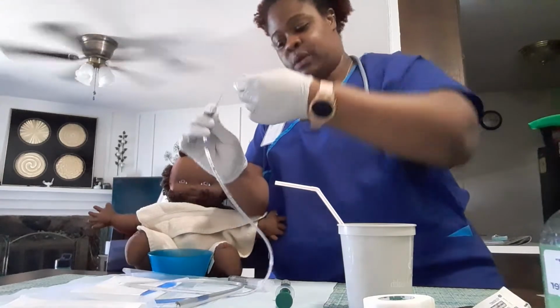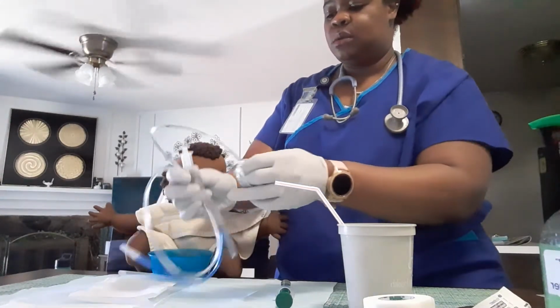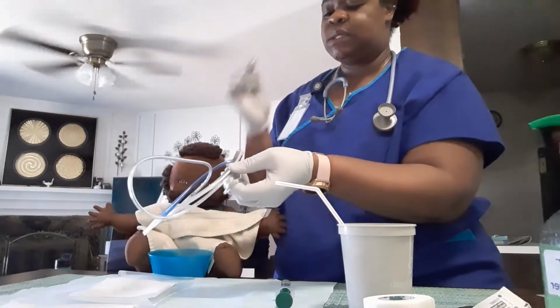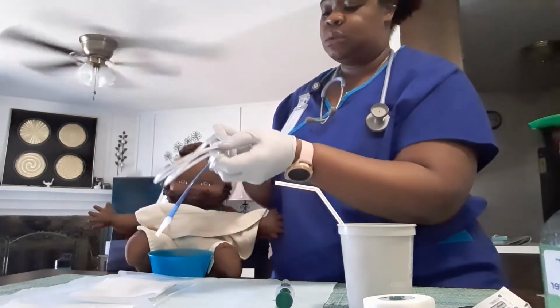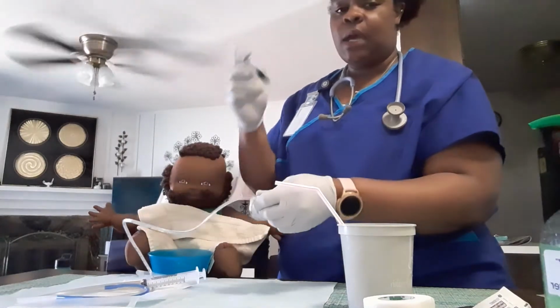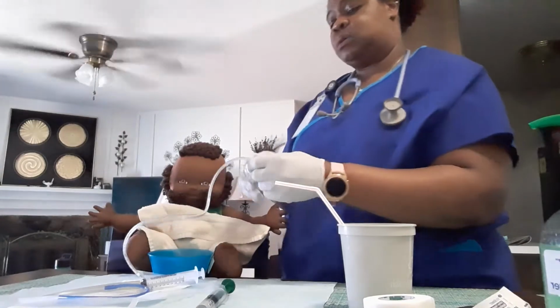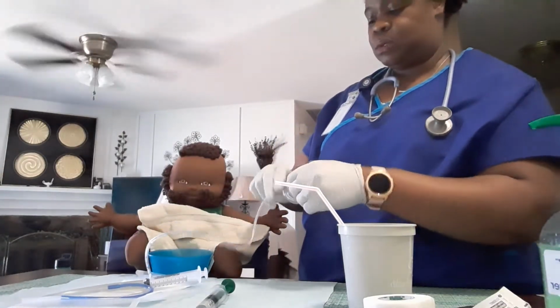And at this point, I'm going to wrap this tubing, trying to get it a little tight. I'm going to attach a 60 ml syringe to catch any gastric content. I have my lubricant. I'm going to put my lubricant down. So I'm just getting my tubing.